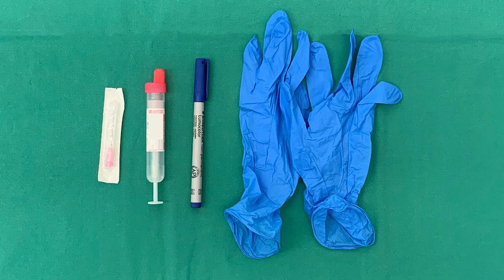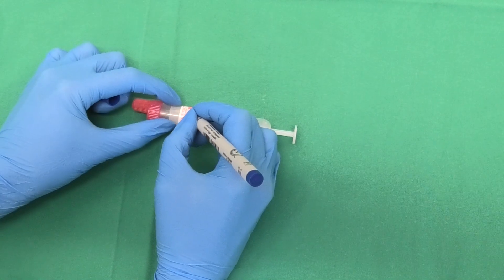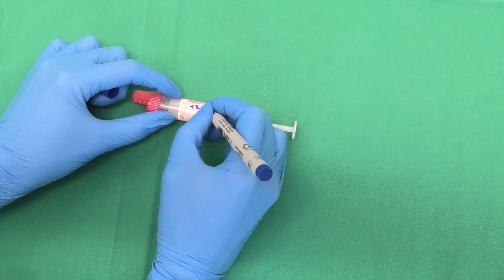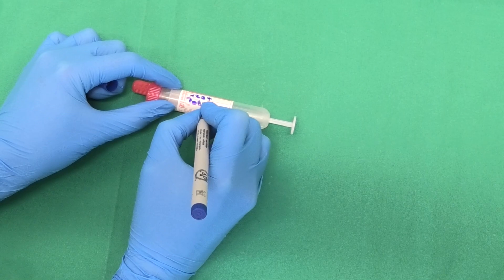All needed materials are placed within reach. The sampling tubes are then labelled with the following: farm name and number, ear tag number, possibly the animal's name and patient number, and the date of sampling.